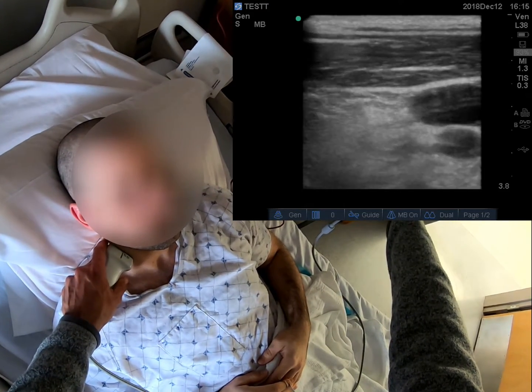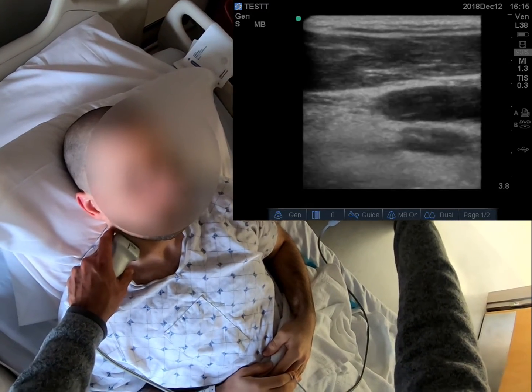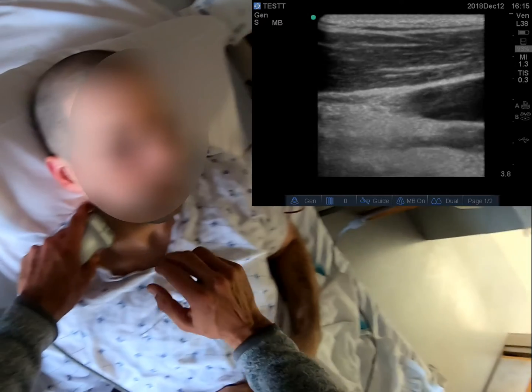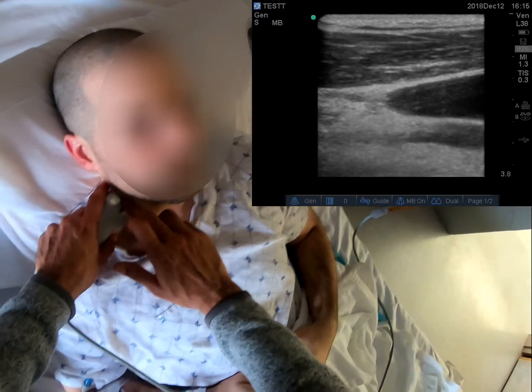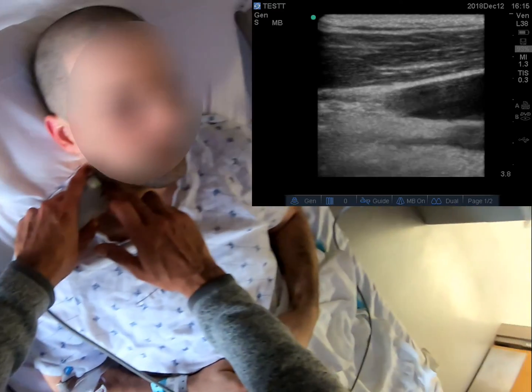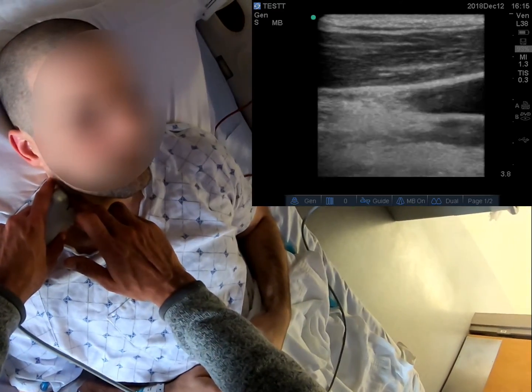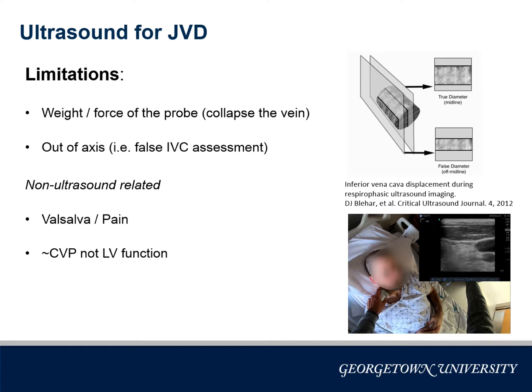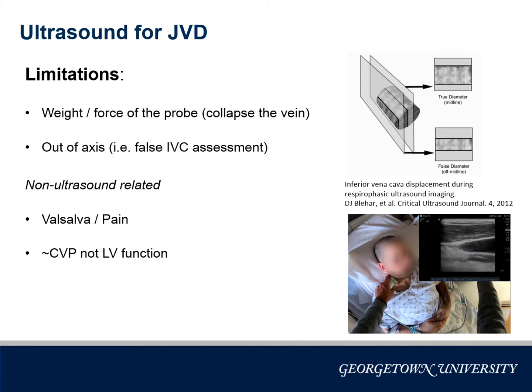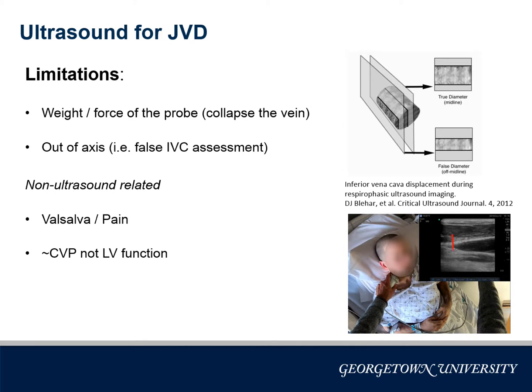Let's see the transverse to longitudinal transition again. This has not been studied much, but in the small emergency room study quoted, ultrasound had a good negative likelihood ratio of 0.01 for heart failure. Some caveats to keep in mind: the weight of the probe, or just operator pressure, can collapse a vein.